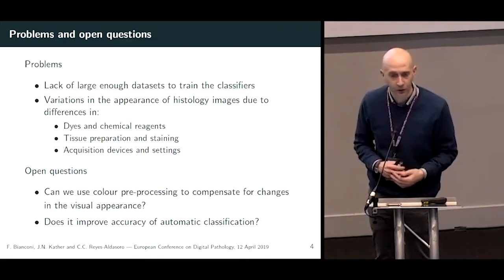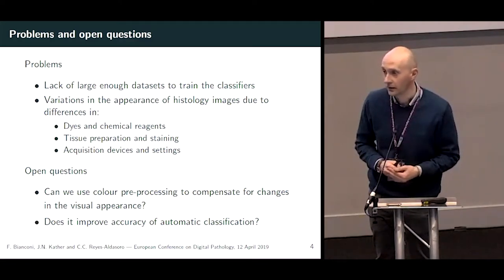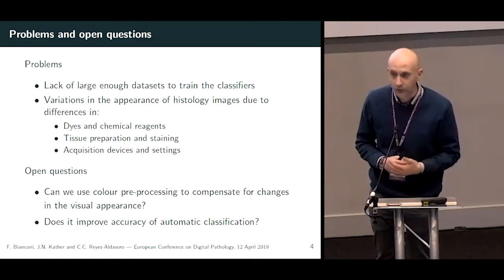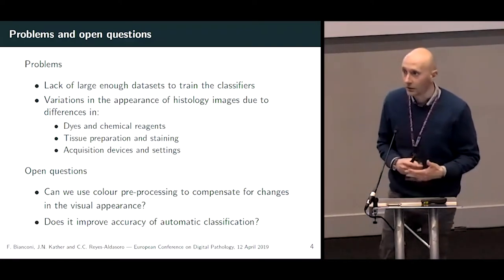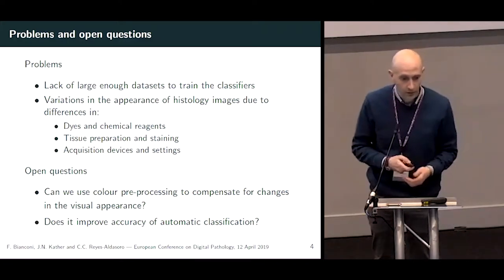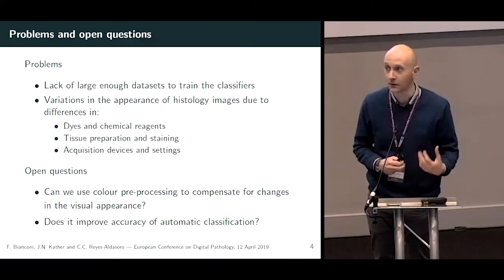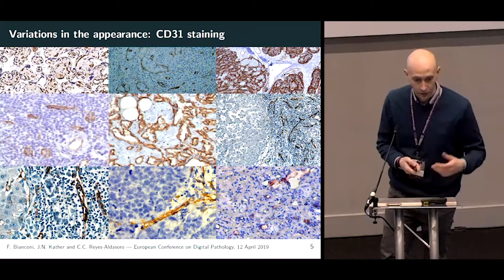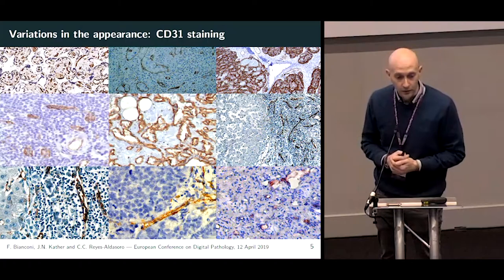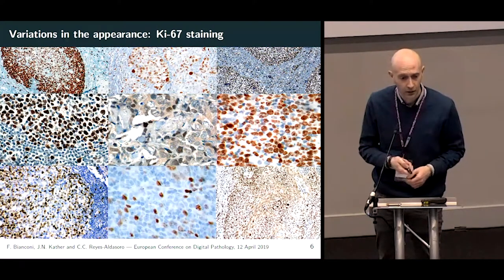Still, there are a number of problems that limit the application of automated methods on a large scale. Among them, the lack of large enough and well-stratified datasets to train the classifiers, and another is the variation in the visual appearance of tissue samples arising from different chemical reagents and dyes, different tissue preparation procedures, and different acquisition devices. In these slides we can see how the change in visual appearance can be quite huge — here we have three different types of staining, and in this work we focused on H&E staining.